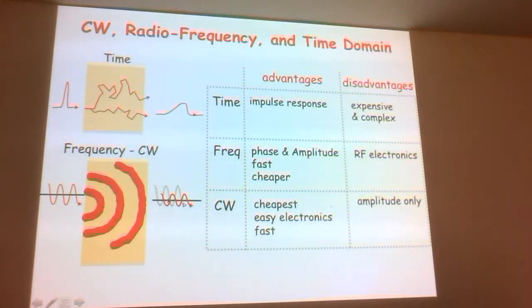So that's all nice theoretically, but experimentally you have to make measurements of these signals. And the vast majority of people doing near-infrared spectroscopy are making measurements with continuous wave systems. So they just have a laser that's on constantly. These are very inexpensive systems, relatively speaking, and very fast because you've got lots of photons. Detectors are sensitive and fast, and you're just measuring amplitude.